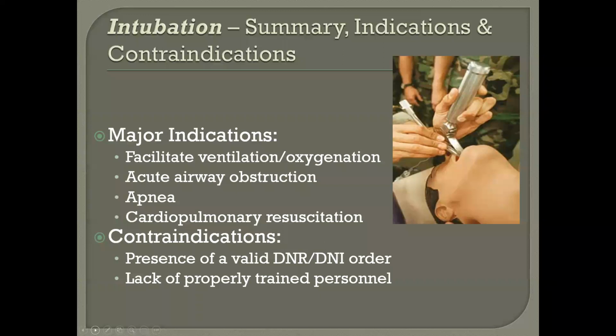Cardiopulmonary resuscitation, so you have a code blue situation. Again, the latest with ACLS is if you can get an advanced airway in, fine. But if you can ventilate the patient with either an LMA or just a bag valve mask, that's perfectly acceptable as well. And intubating the patient during cardiopulmonary resuscitation, generally speaking, it's best to wait for a pulse check, because they're really not supposed to stop compressions, and it may present a bigger challenge to intubate the patient while compressions are still going on.